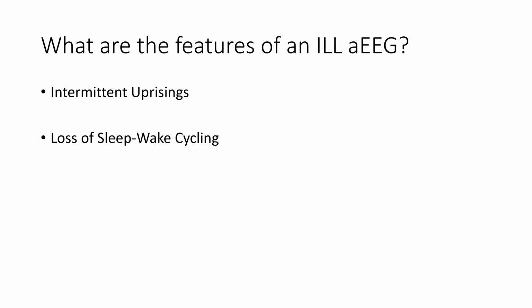I see this a lot in the cardiac babies. So they're kind of plugging along on PGE. They have kind of low mixed sats that we are expecting. And when you monitor them with aEEG, they have okay background patterns. So their voltage is good, but the hypoxia just does not allow their brain to organize into that rhythmic sleep-wake pattern that you would expect for their age. And it's just one of the hallmarks that I've seen over the years of this loss of cycling.